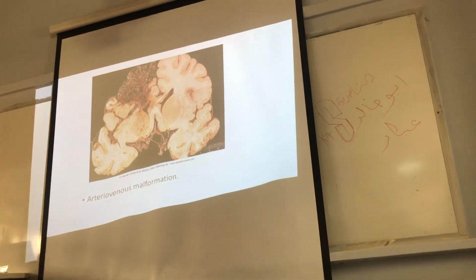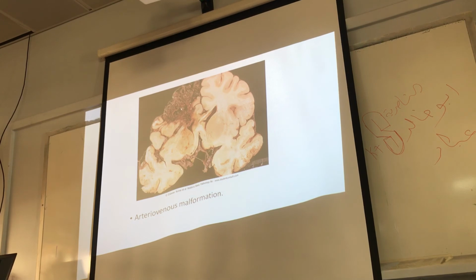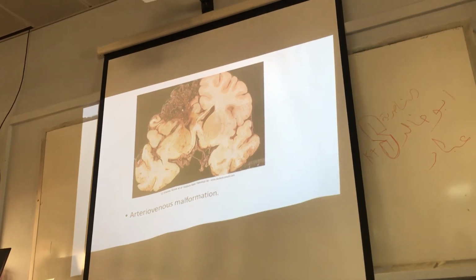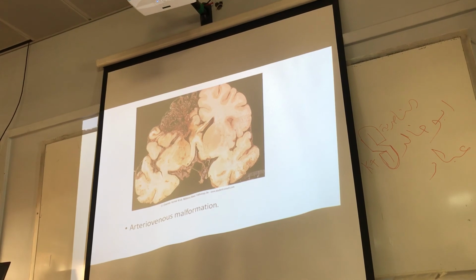This is arteriovenous malformation, a tangled, irregular mass of vessels. What is the cause of this? Congenital.